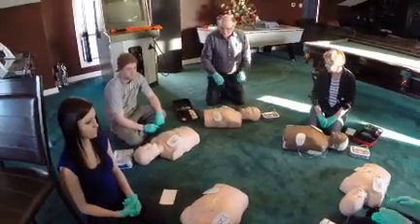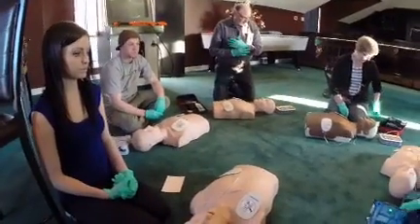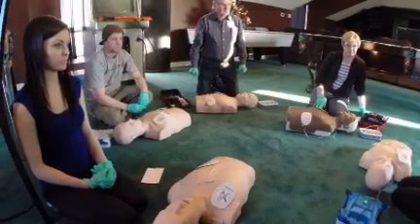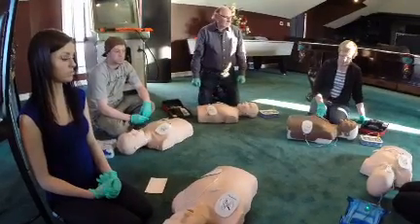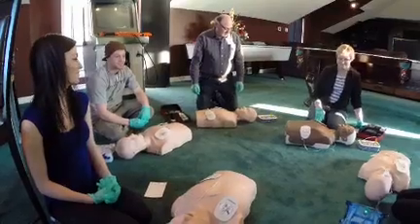If you don't have an AED machine that gives you a timing for that, you can think of a song that's Staying Alive and sing that in your head as you're doing it. That will give you the proper rhythm as well. Just might not want to sing that song out loud as you're doing it. It might not be a good idea. Give 2 breaths.